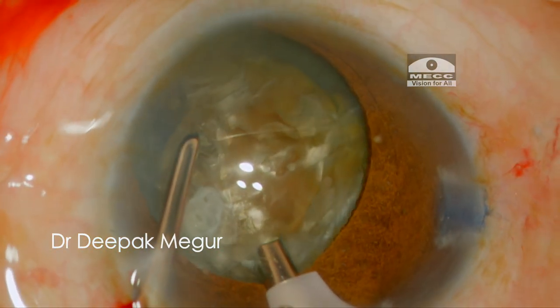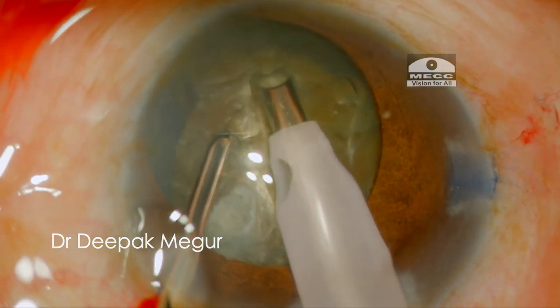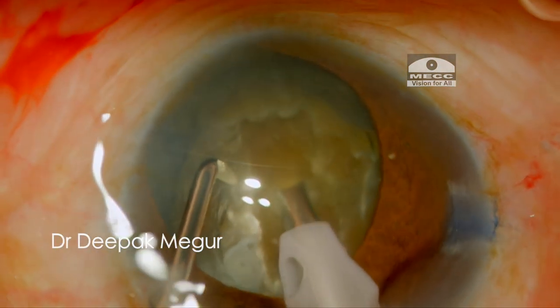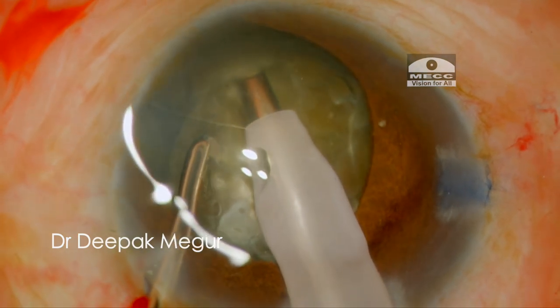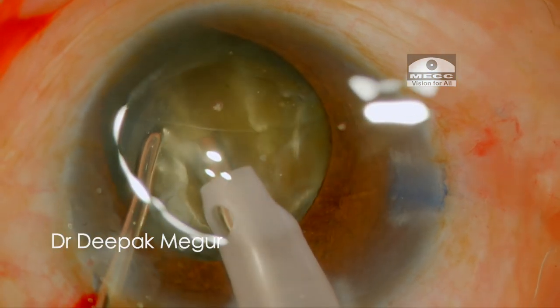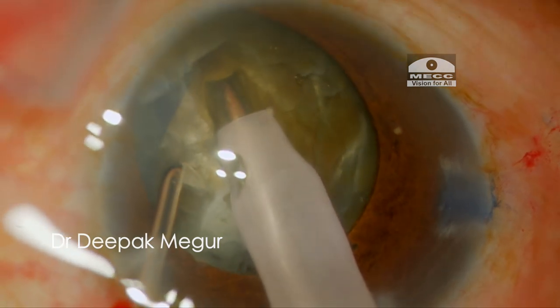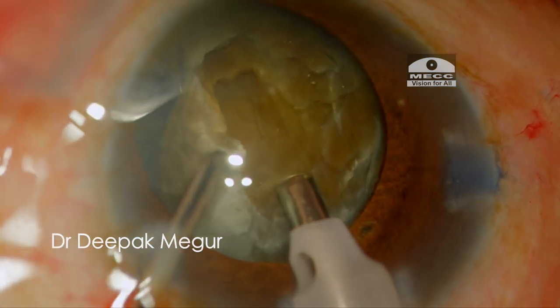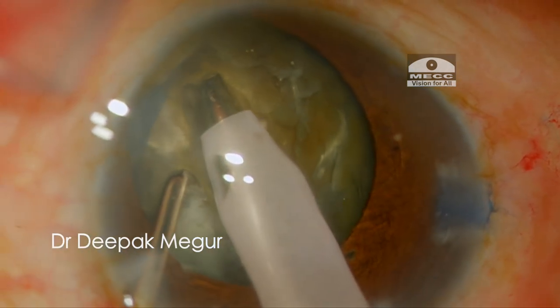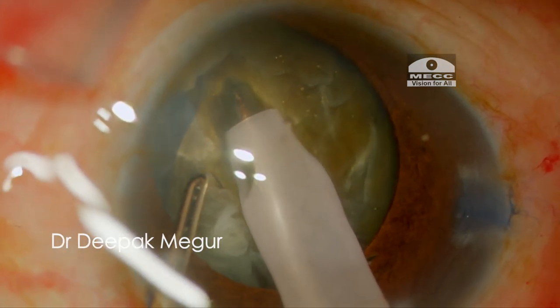My plan is to perform a four-quadrant divide and conquer technique instead of a direct chop, which I usually use. The reason being the four-quadrant technique will induce less stress on the zonules and the anterior capsule during lateral separation. Also, carving out the central dense nucleus helps in creating enough space in the anterior chamber, which is going to be of great help during nucleus manipulation. The chances of wound burn with this technique would be minimal because I'm using torsional ultrasound in this case.